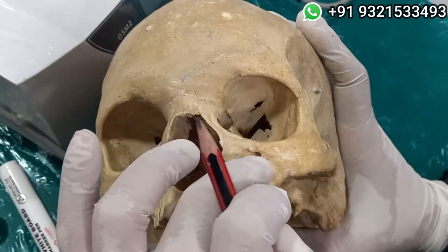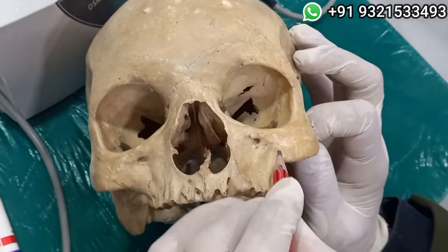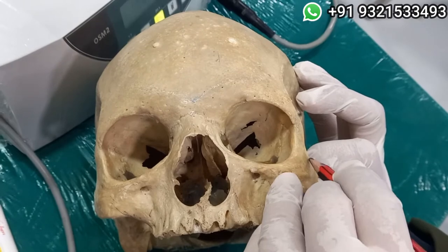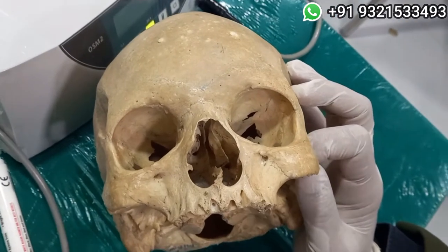at all. If the infraorbital foramen is seen, it's okay. If it's not seen, don't worry. Now, once this is done, you locate the zygomatic bone, which for your understanding, I'm just drawing right now, is this bone over here. Okay. And we wish to enter this zygomatic bone.